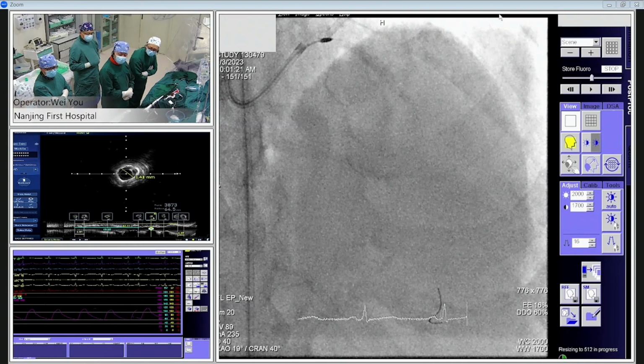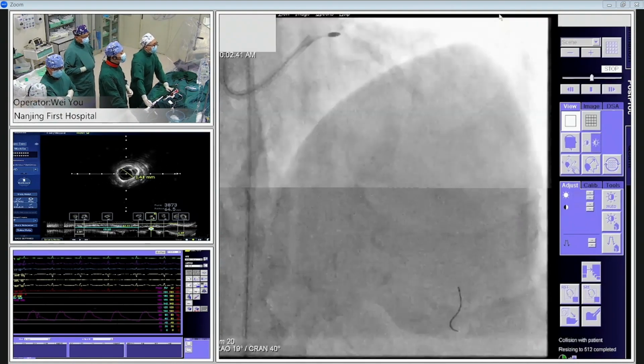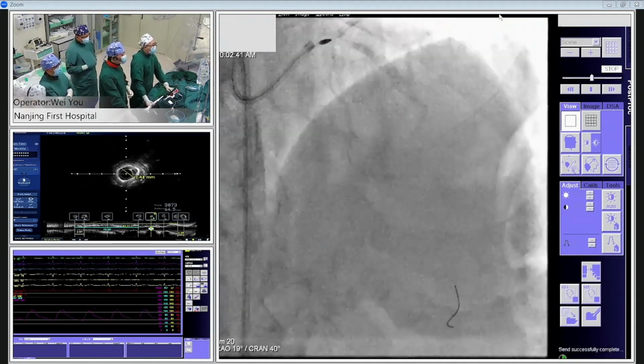We have the speed deceleration, more than 5,000 RPM. I feel the resistance when I touch the lesion. Okay, let us know over 30 seconds. I think it's okay. So already, Chief, we perform the second run. Second round. 160,000. Yeah, there is some resistance. I can feel, here is our target, very severe and circular superficial calcified lesion.